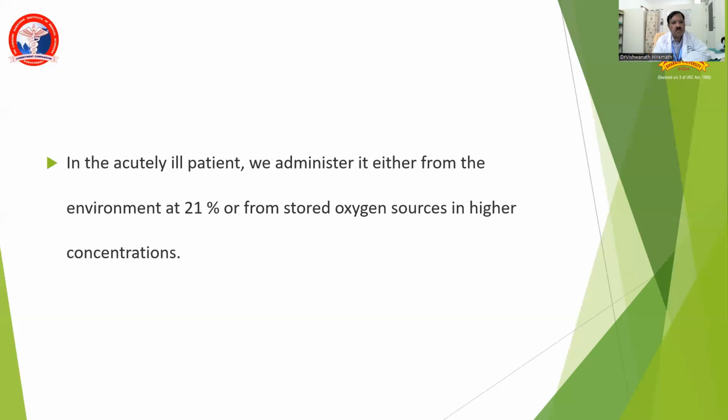Oxygen therapy is indicated for acutely ill patients, and it is administered either from the environmental oxygen, which is available at 21%, by means of a device like a bag valve mask, or from the stored oxygen sources in higher concentrations.